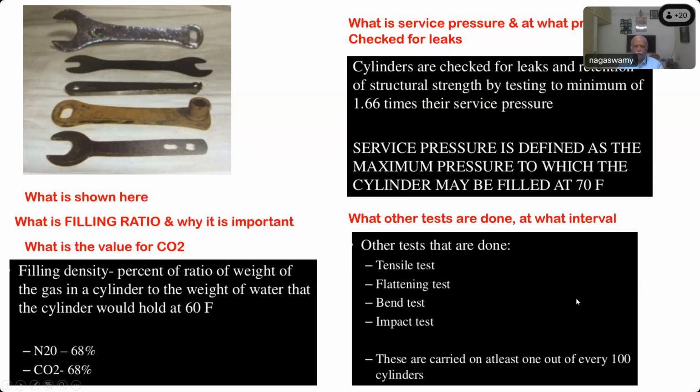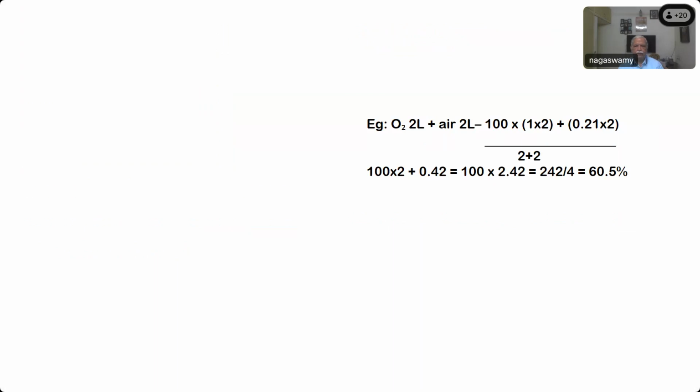It will be done in batches. One cylinder is like checking one grain of rice to judge the whole pot. You check only one cylinder out of 100 and then try to see whether all of the cylinders will be of the same capacity and strength. Okay.